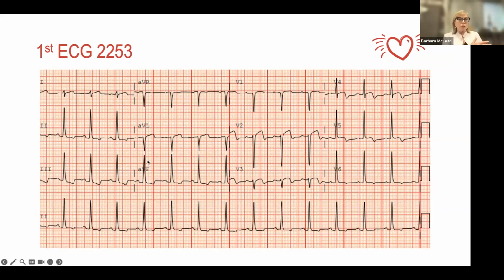That means his current is shifting towards the foot, and we're going to consider this to be a right axis deviation. Now, my purpose here today is not to teach 12-lead EKG, so hang tight with me. He has a right axis deviation, okay? I'm going to look globally. I'm going to go over to the chest leads, and I'm going to say, do I have an upright, a number 1 upright, downwards, and a second upright in V1? That would indicate a right bundle branch block, a very common cause of right axis deviation. He does not have that, but he does have an acute right axis deviation.